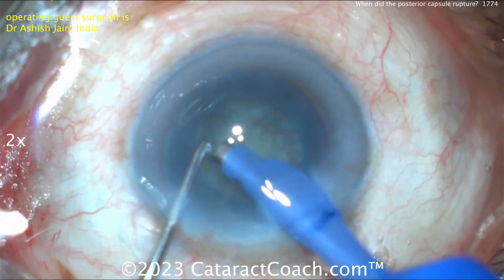Here comes the optic capture — there's that characteristic football shape, looks fantastic. At the end of the case, seal things up. I'd put a suture in too. Leave me a note down below — let's go.